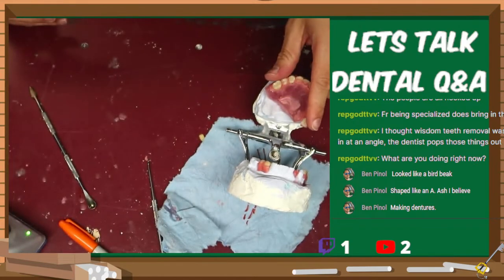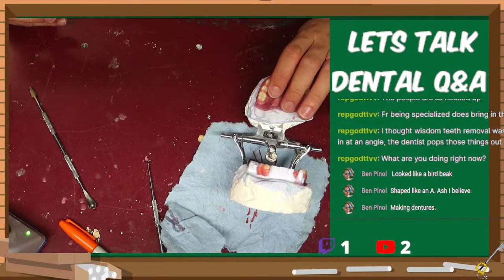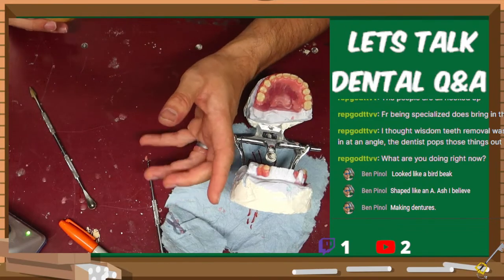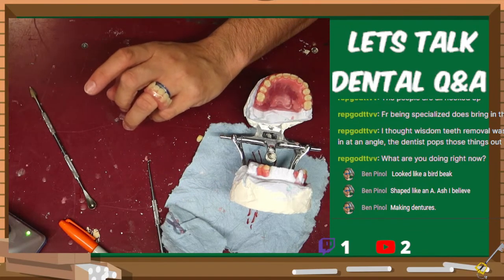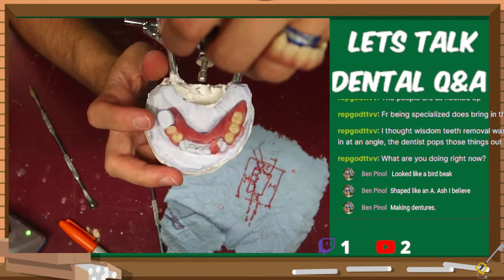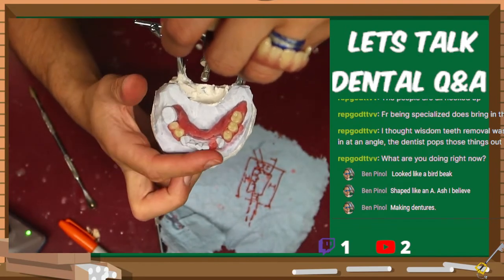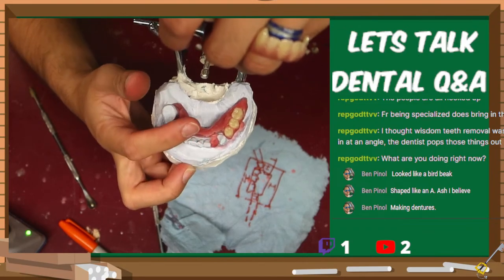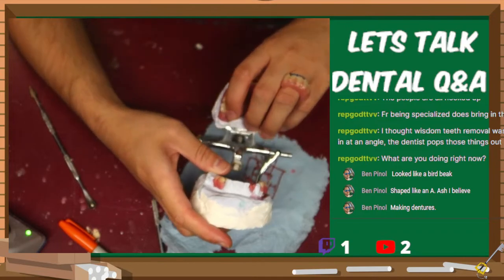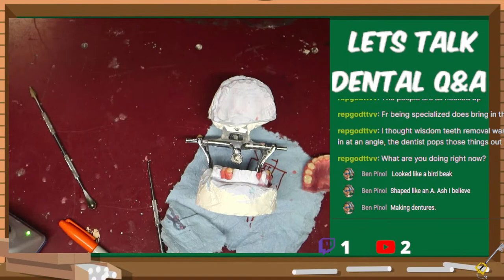For this other one that I have over here that I've been working on, this is more of a partial denture that's over here on the bottom. This partial denture is only replacing some teeth. And in that case, like we see right there, we still have teeth in the mouth. We still have a molar over here. We have a couple of anterior teeth, a couple of front teeth, and this one canine over here. All the rest of it that's in pink and bright white is going to be replaced, hopefully, as I continue to go and make my different pieces. So that's all I'm doing.